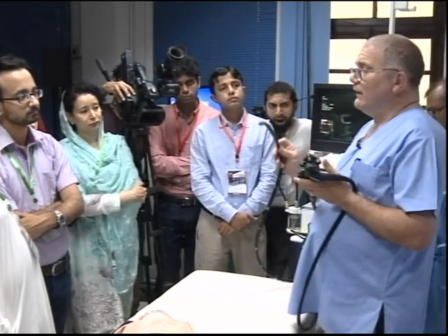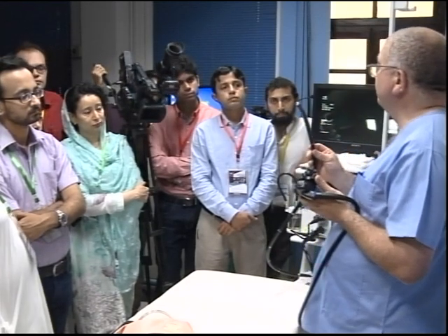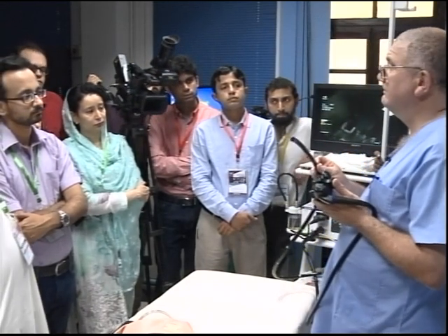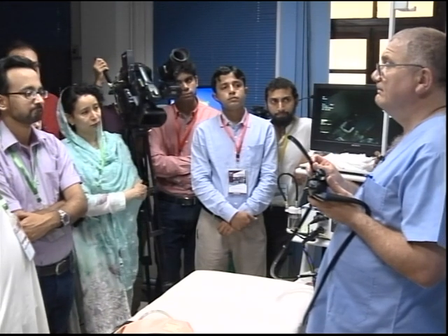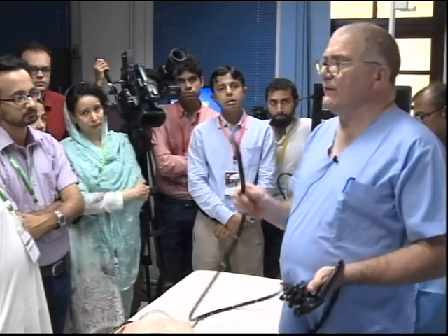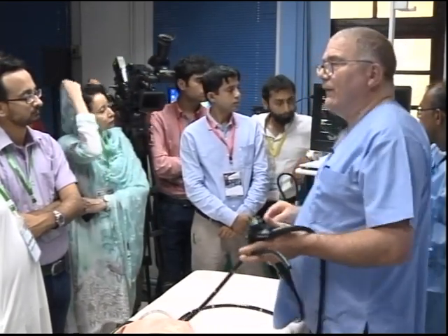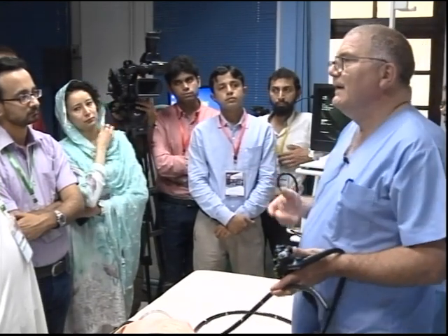So if there's water dripping out of the end of the scope, what do you think is the problem? I pick the scope up and there's water dripping from the scope. I put the scope in the patient and you can see water coming on there. It happens all the time. Yes. So what's the problem?